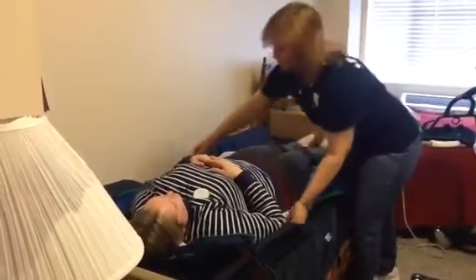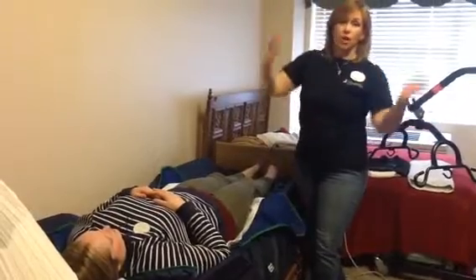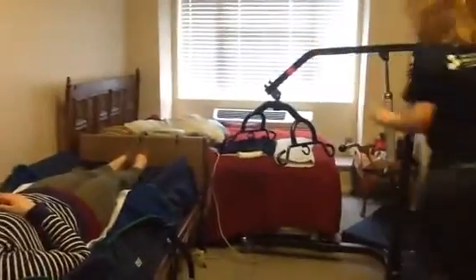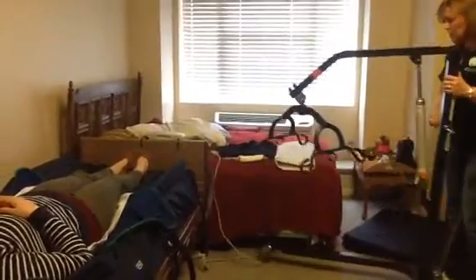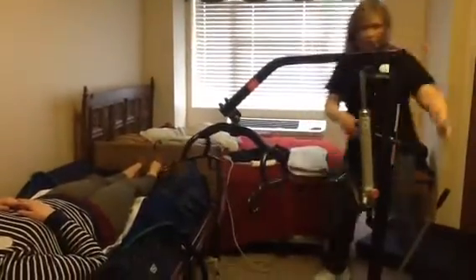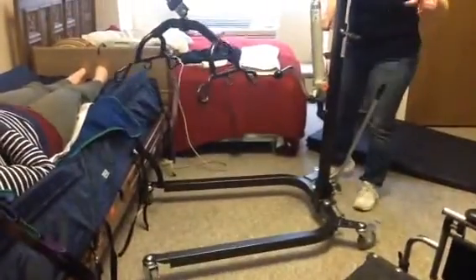So you have your sling and you have them positioned. You want to make sure it's even on both sides. That helps you when you're lifting them up in the air so they're not lopsided and they don't tilt. So once you get your sling in place, you wheel the Hoyer under the bed. You keep it closed. It also opens. That's for when you move to the chair.